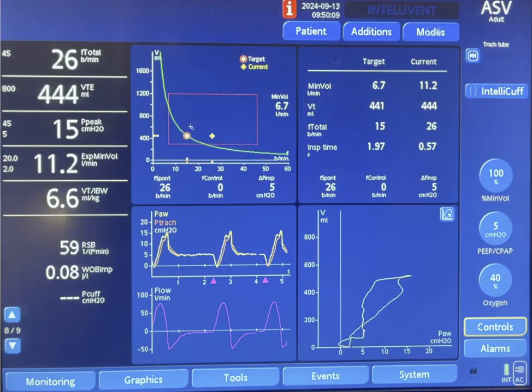But the machine will not let him get larger tidal volume because if he started to inhale deeper it will lower the pressure support to keep the tidal volume at this range. That's number one.